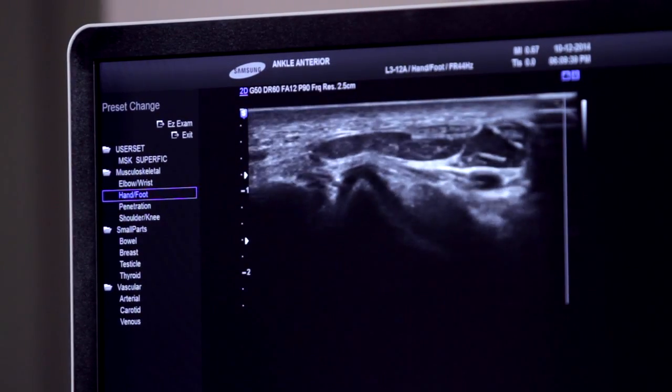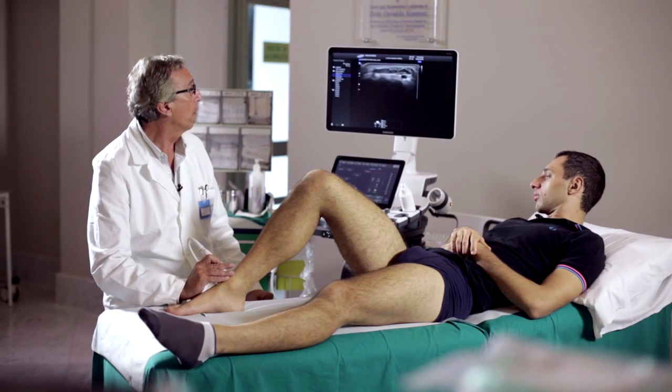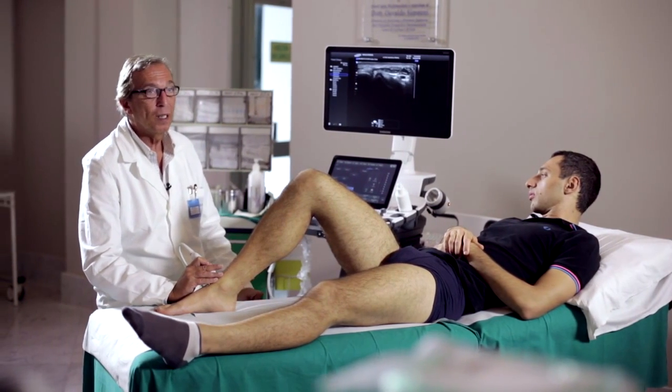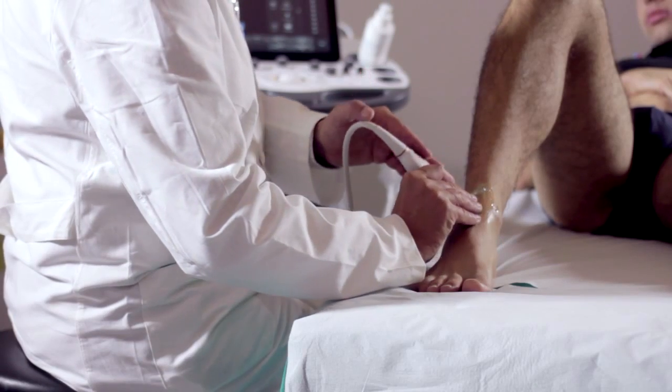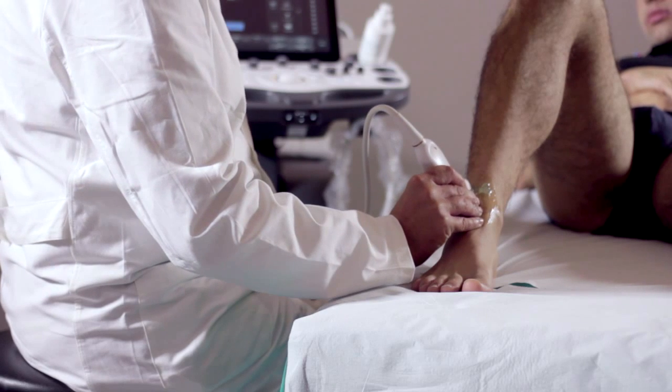We then end the evaluation with the extensor digitorum tendon, which is even thinner than the other two, and, being the last tendon of the anterior compartment, is placed sideways. Even in this case, as for all these tendons, we do two scanning planes, one on the short axis and one on the major axis.